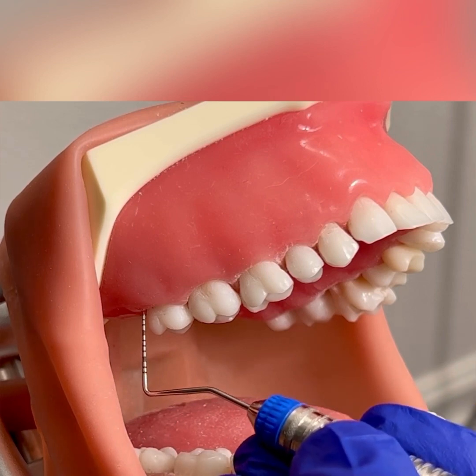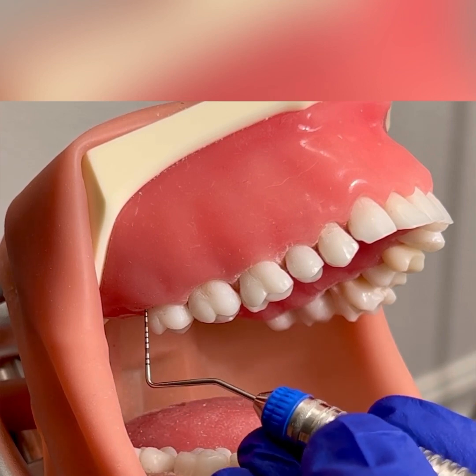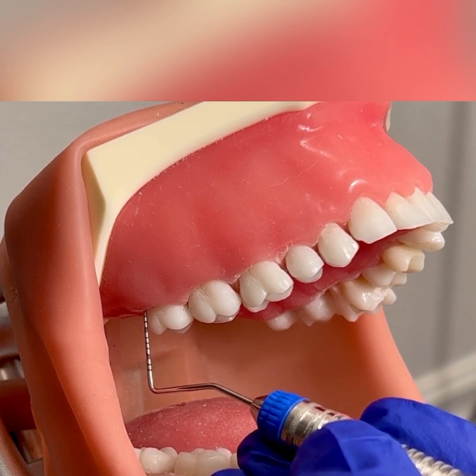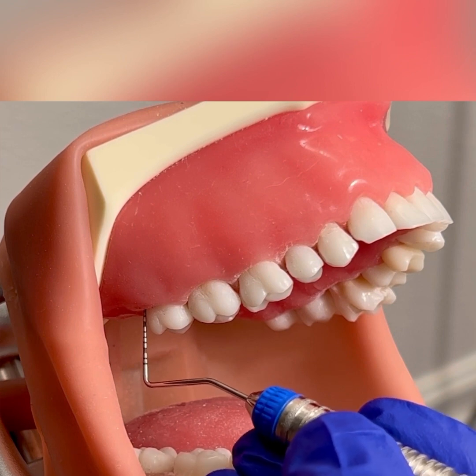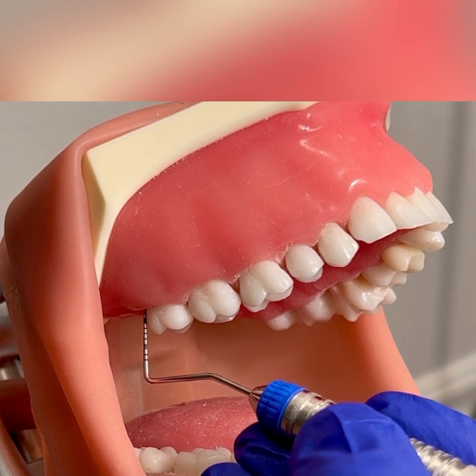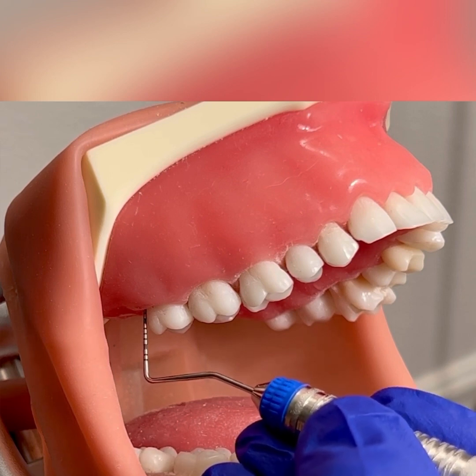I'm going to insert the probe at the distal buccal line angle. I'm in contact with the tooth. I'm going to walk the probe, keeping it parallel, walking it into the distal and proximal. When you feel the junctional epithelium, that's where you're going to measure that first reading.